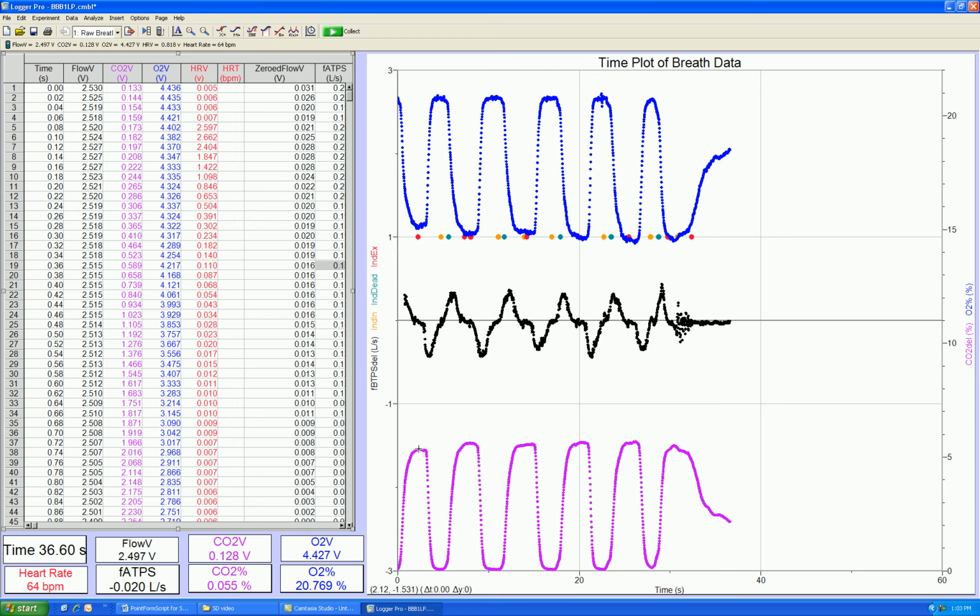When oxygen is low, carbon dioxide is obviously high during an exhale. During an inhale, the carbon dioxide value is nearly 0%, the background carbon dioxide level in air, and going up to about 5% during exhale.